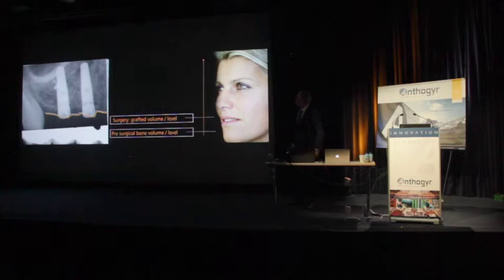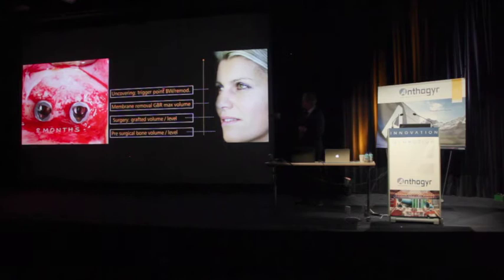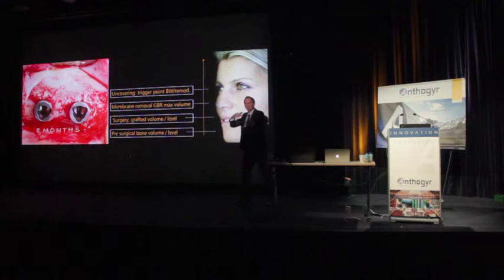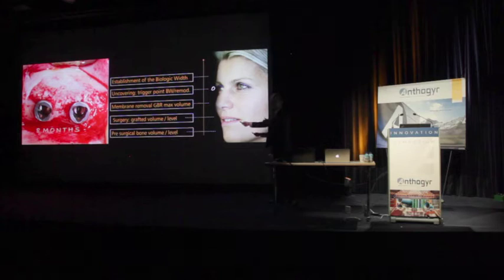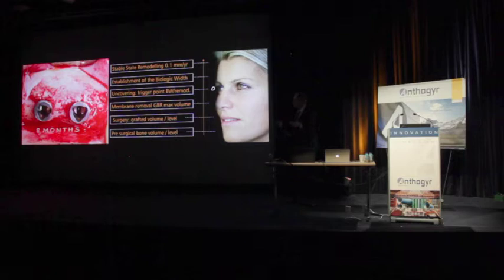And after the removal of the membrane, a remodeling process is triggered off. And you get development of the biologic width from this moment on. So 8 months after the grafting, this bone starts actively remodeling. So this is my zero moment. If we wait a couple of months, you get establishment of the biologic width, and if we go by the book, every year we should lose maybe 1/10 of a millimeter of bone. This is from the Brånemark literature. So this should happen with this patient.